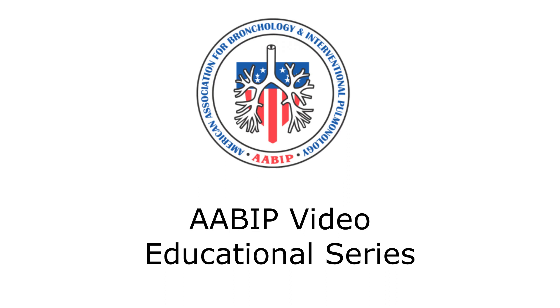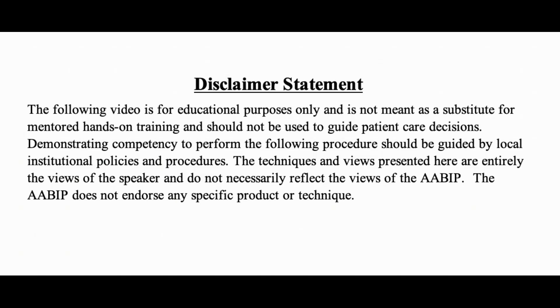This video will demonstrate the equipment that is used in the performance of the Monarch bronchoscopy and important details of each.